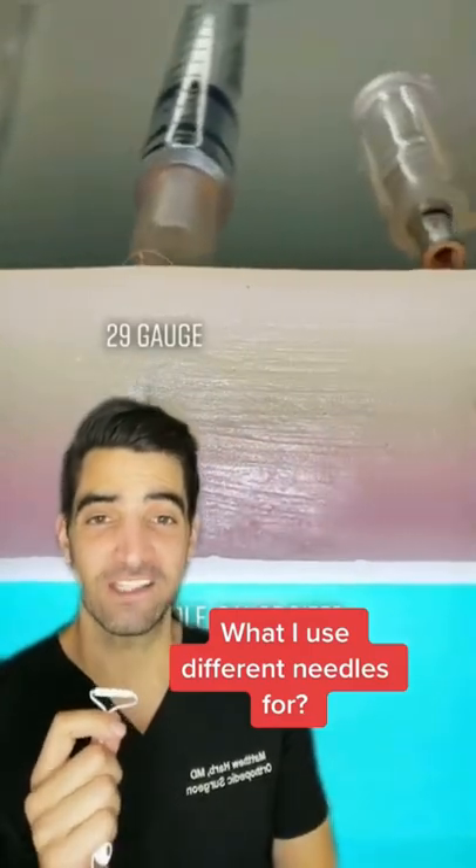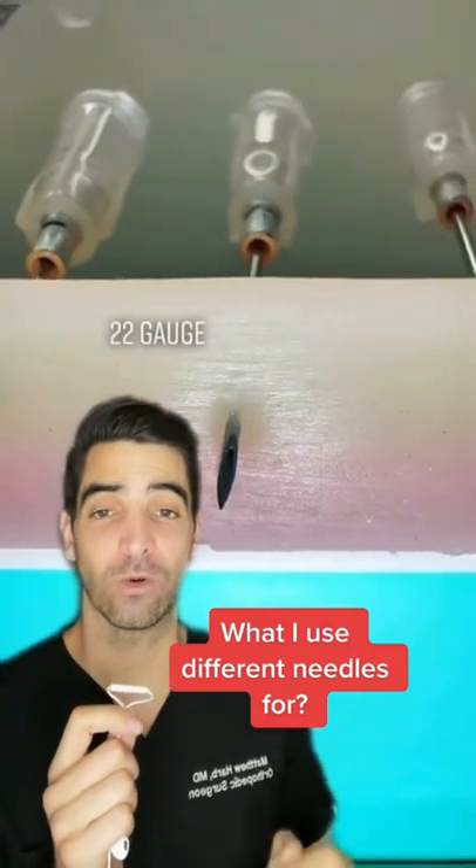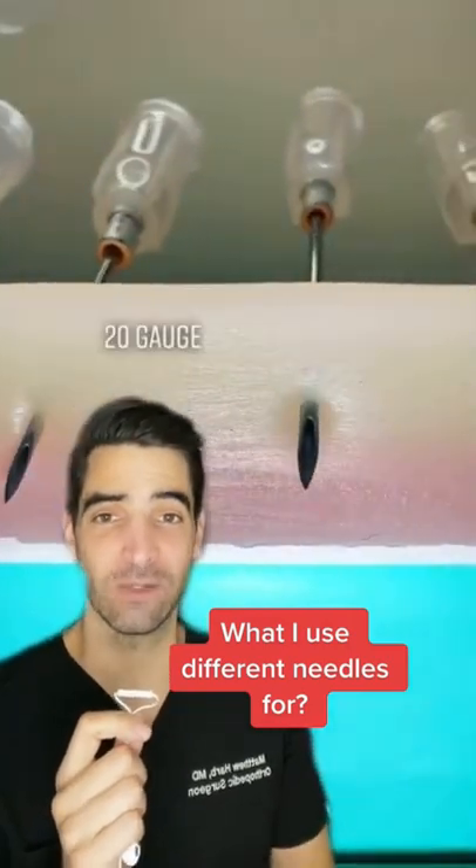29 gauge I'd use for a face injection. 25 or 26 gauge I'd use for a hand or foot tendon. 22 I inject a knee with.